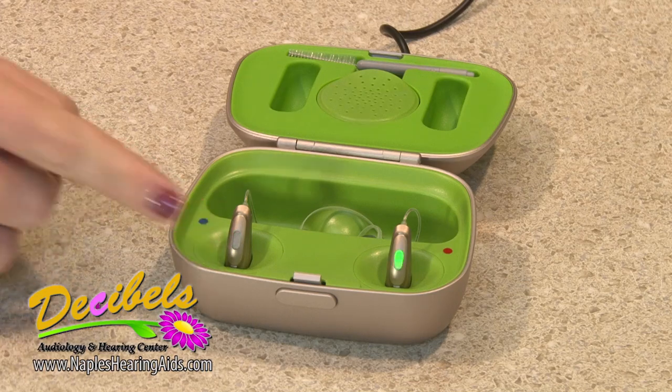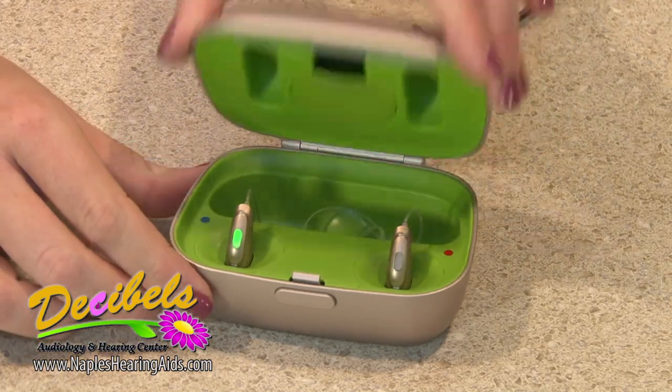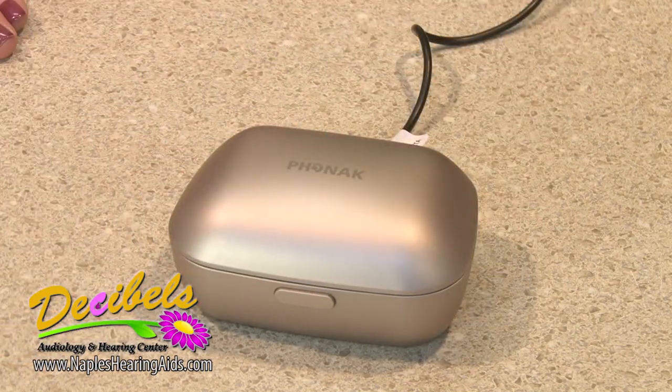Green lights will start flashing. This means that they are charging. You can now close your lid.